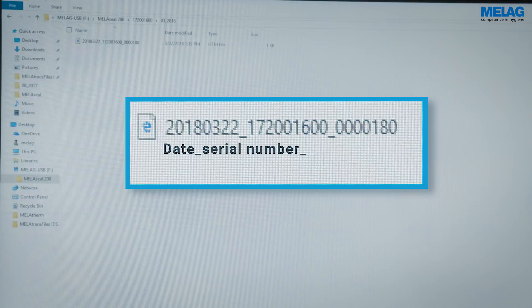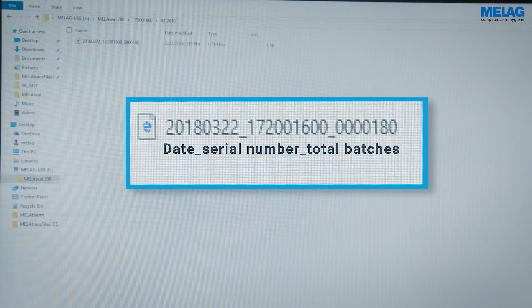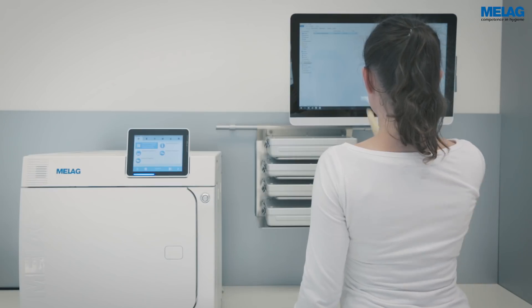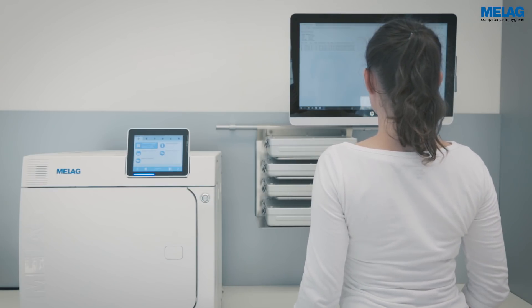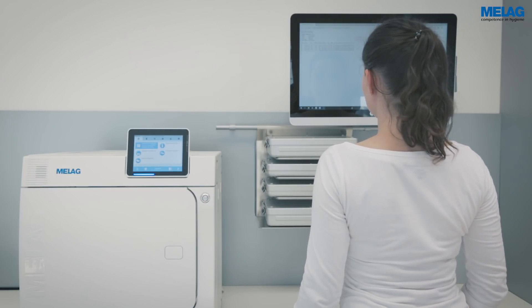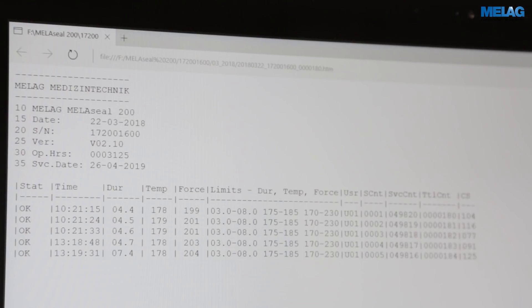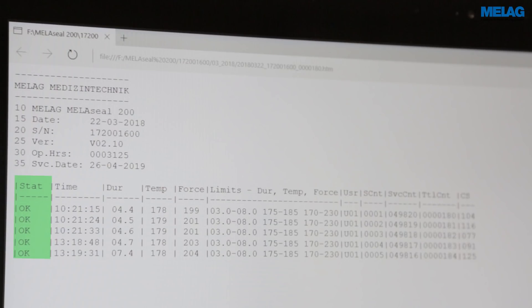The file name informs you about the date, the serial number and the total batch count of the MELAseal 200. An open log file displays all the sealing procedures and parameters of a day. The OK in the first column reassures you that the corresponding sealing process has been performed successfully.